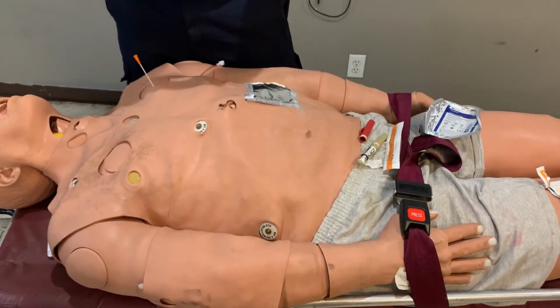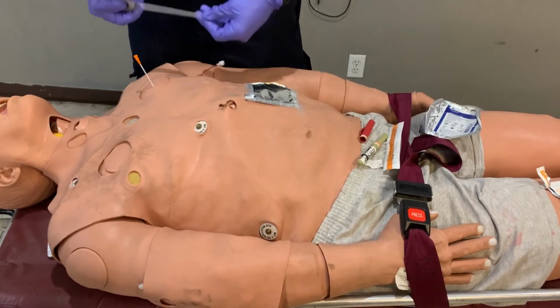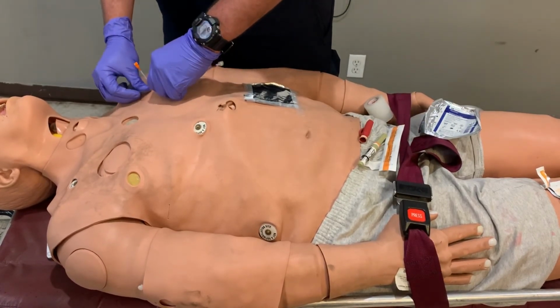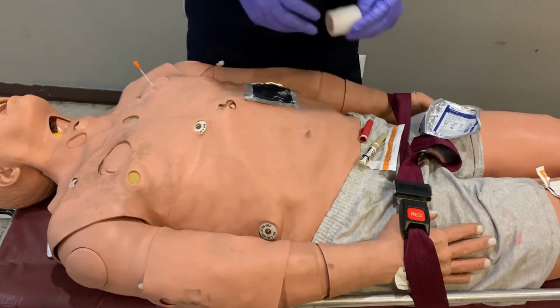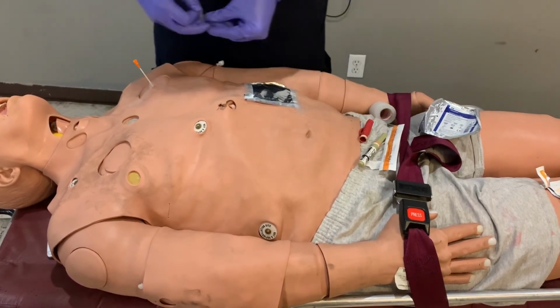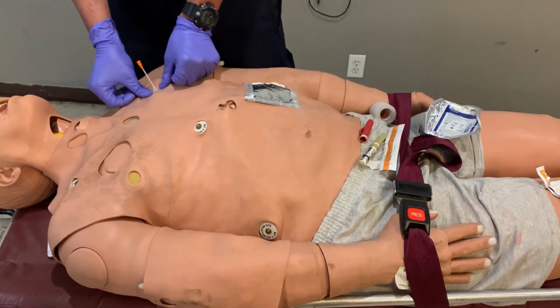Once you have that catheter in, you'll want to stabilize it, and just some tape will do. Just like whenever you tape an intubation tube, or an IV, it's pretty much the same thing. You're just wanting to stabilize it, making sure it doesn't move up or down anymore and doesn't wiggle out.